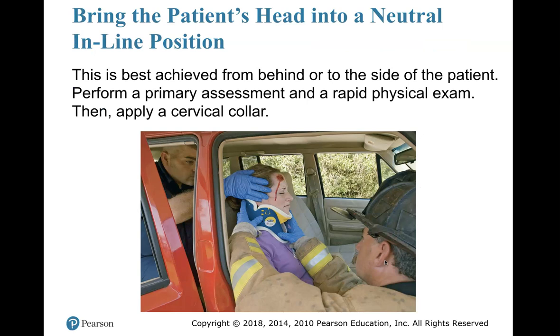All right. Bring the patient's head into a neutral inline position. This is best achieved from behind or at the side of the patient. Perform a primary assessment and rapid physical exam, and then apply a cervical collar.